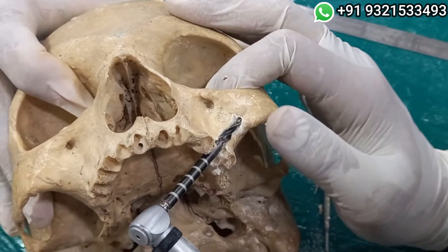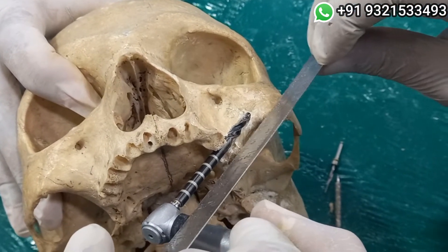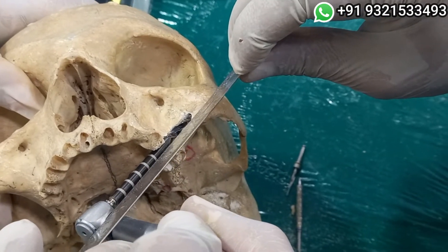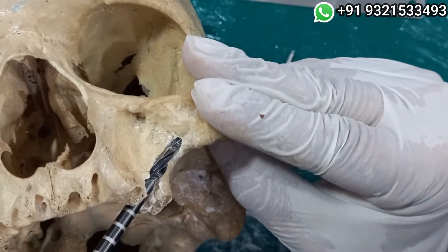Now I have entered into the zygomatic bone and this is the right time to recheck if I am parallel and not entering the eye. And now I will keep my hand extra-orally.